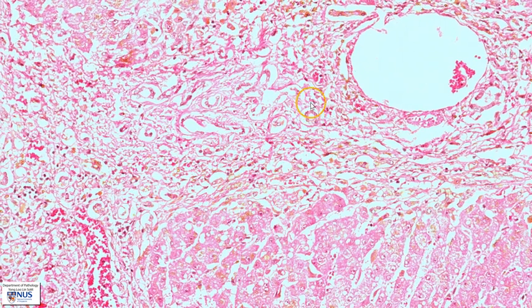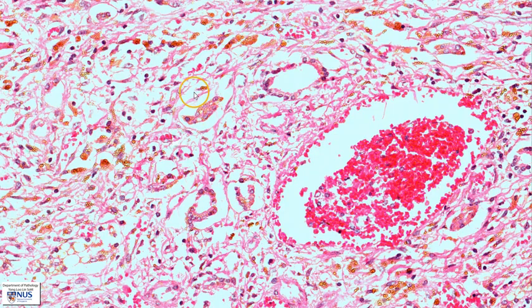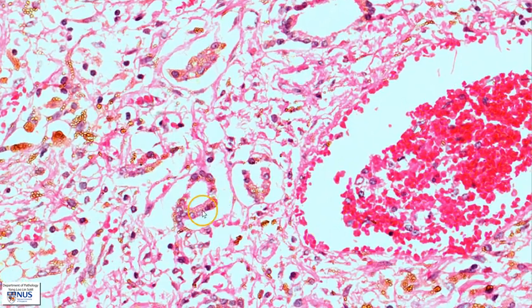Over time, the pigment can also be found in the cholangiocytes, which line the small bile ducts. We can see that within this fibrous septum, there are a few small proliferative ductules. In this area, although there is some poor fixation artifact, we can see some bile ductules, and these are lined by cuboidal cells. Within these cuboidal cells, we are able to appreciate this brown iron pigment.